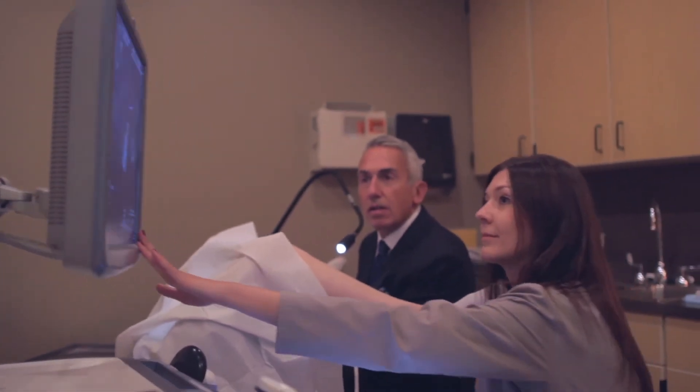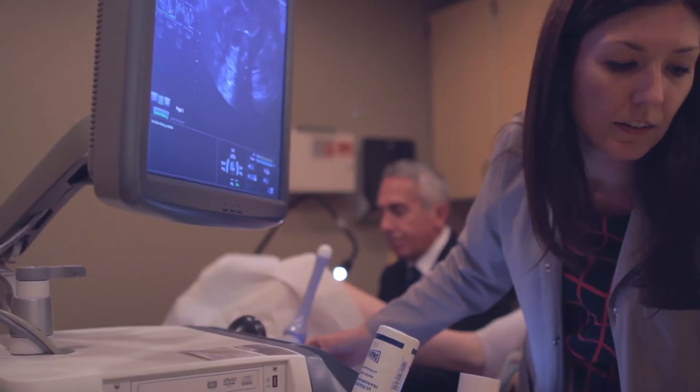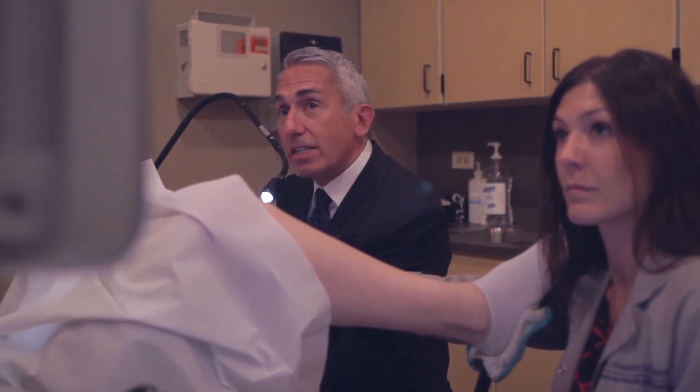I used ultrasound and found that the tubes were not patent. But how was I able to do that? Well, I used this catheter — the Miller Advanced. I saved her a laparoscopy by being able to complete the procedure with the Miller Advanced Catheter.